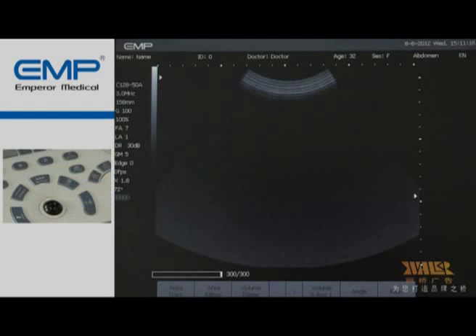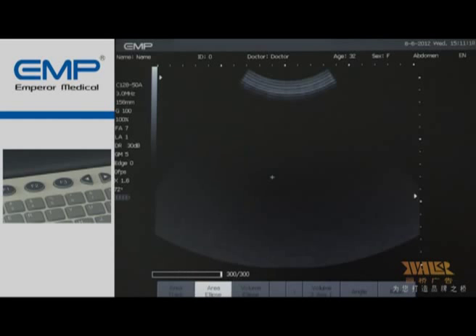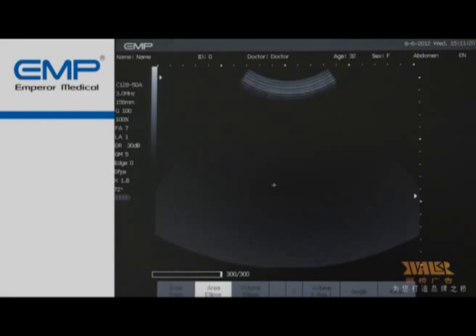If you want other measurements, press the measurement button. Then press F1 to F6 to choose the item you'd like to measure. Let's take an area for example. Press F2 to choose area, ellipse. Move the trackball to one point and press Set. This point is the starting point of the long axis. Then move the trackball to change the length of the short axis to confirm the size of the ellipse. Then press the Enter key, and the selected area will be measured.